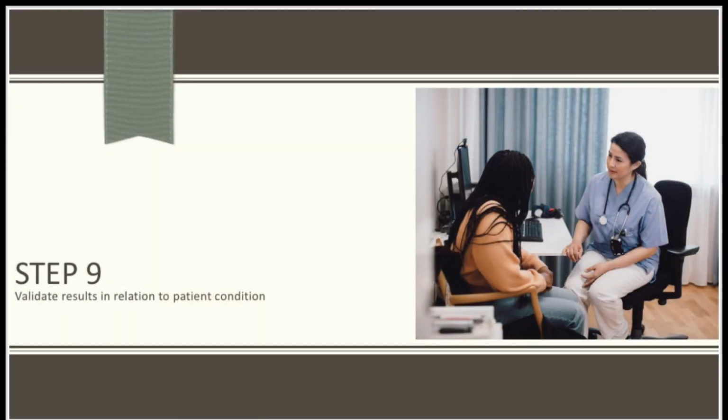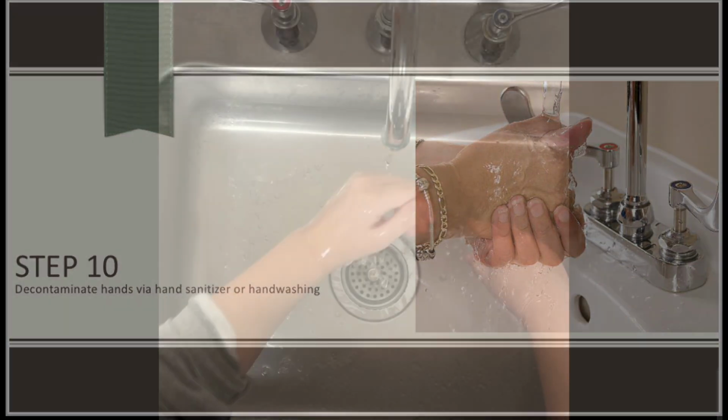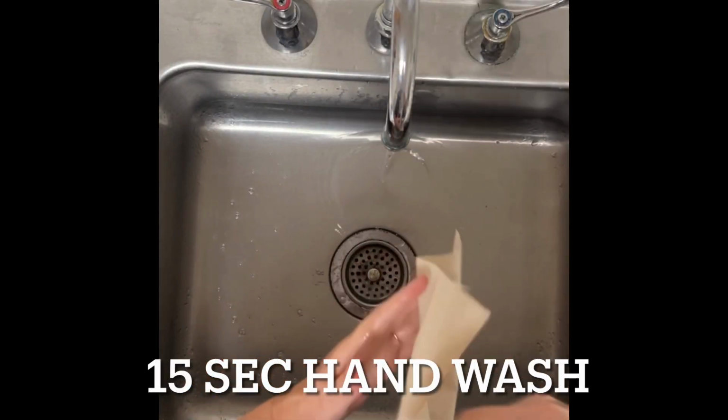Once you have gotten your results, you can validate these in relation to patient condition. As always, before you leave the room, you should decontaminate your hands by using hand sanitizer or a 15-second hand wash.